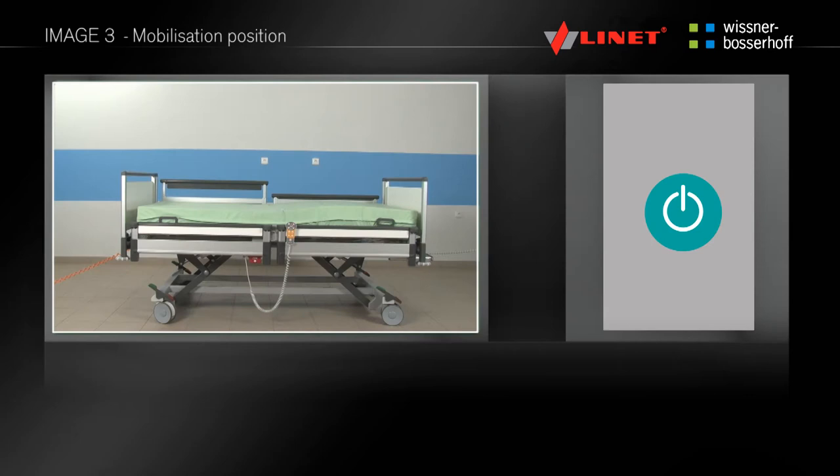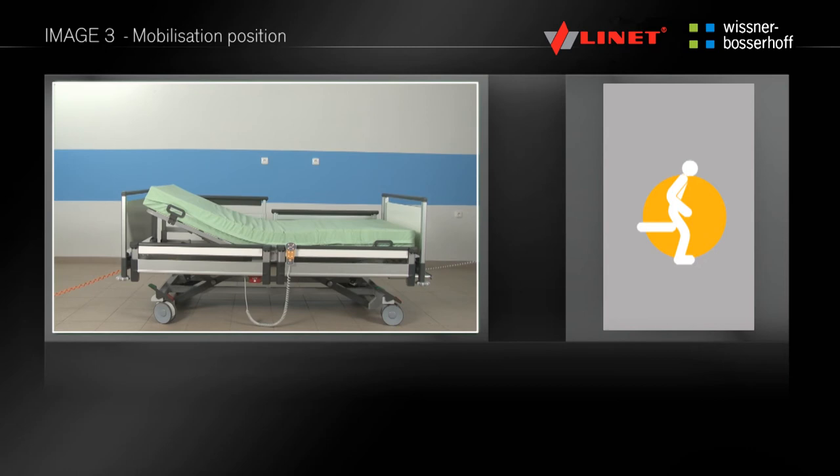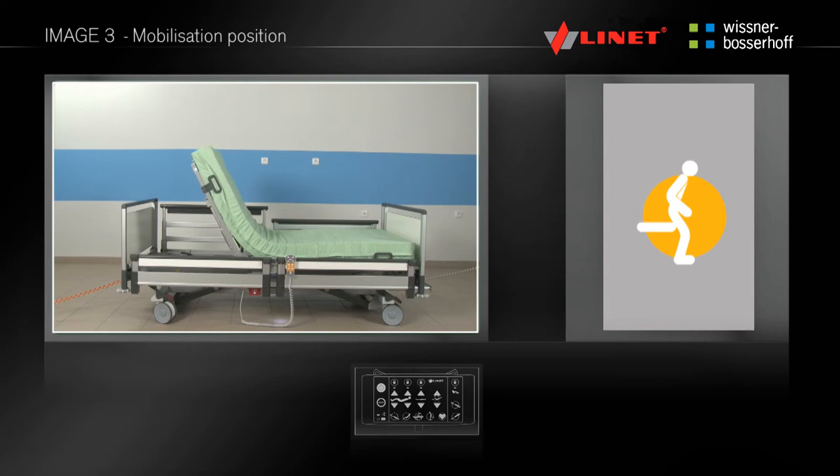By pressing and holding the button, you can set the rising position. The backrest is set to the maximum angle and the thigh rest to the horizontal position, and at the same time the mattress platform is positioned to a height of 42cm for better standing up. This function can be found only on the supervisor control panel in the area of pre-programmed functions.